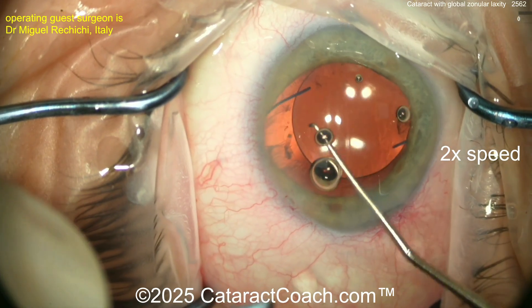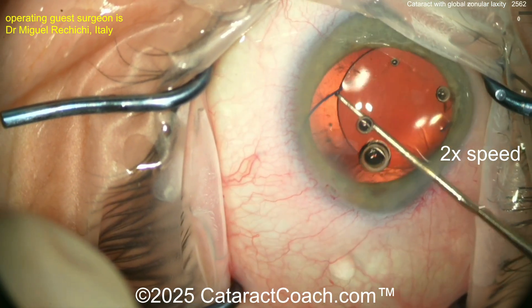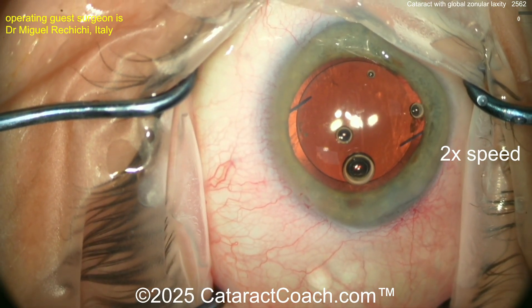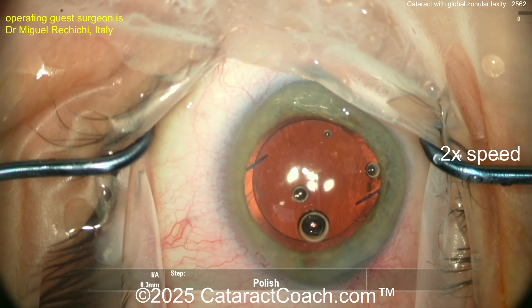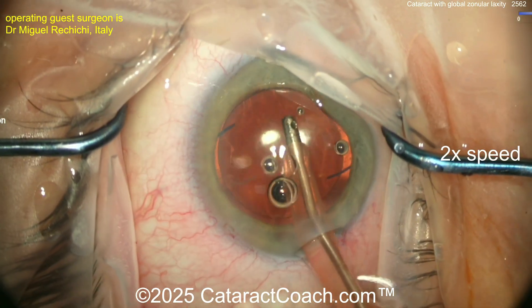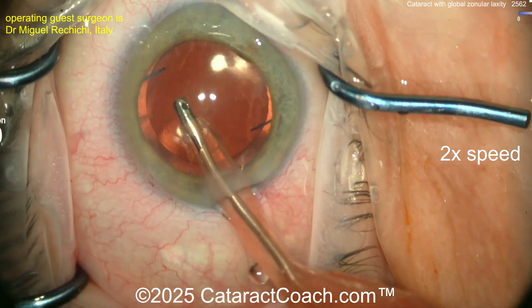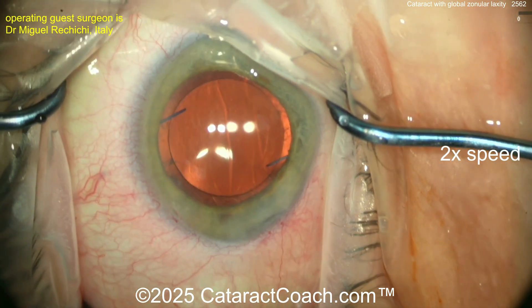If you have global zonular laxity from pseudoexfoliation or whatever else, a great technique for long-term stability is a CTR in the capsule bag and then a three-piece lens with haptics in the sulcus and optic captured through the capsulorrhexis. David Chang had a video where he put the entire three-piece lens in the bag with CTR, moved the eye, and you could see the whole thing was shaking — pseudophacodinesis. Then he reversed it: haptics in the sulcus, optic captured, moved the eye — no movement, no more pseudophacodinesis.